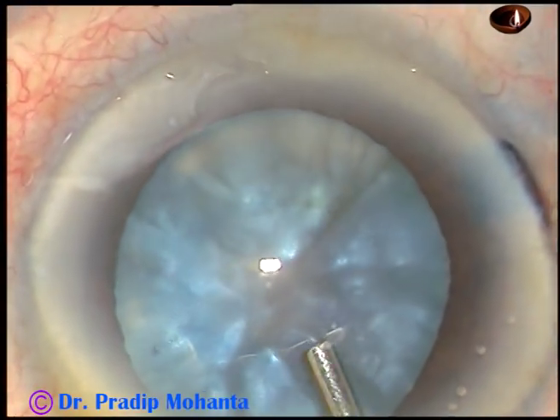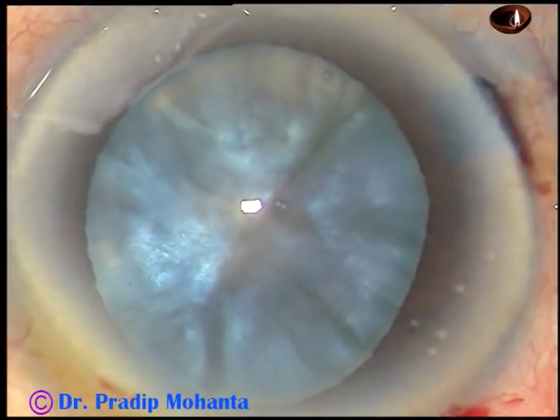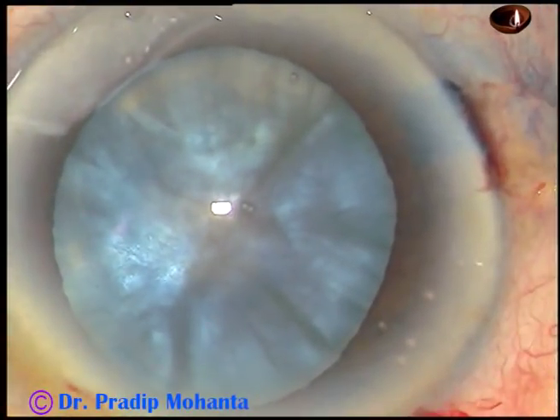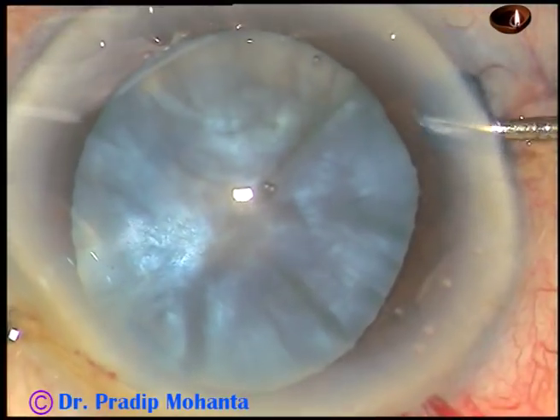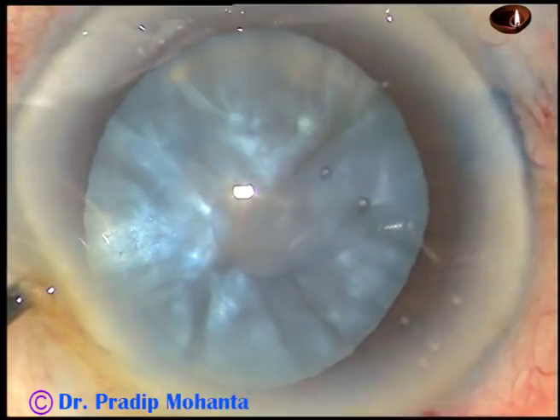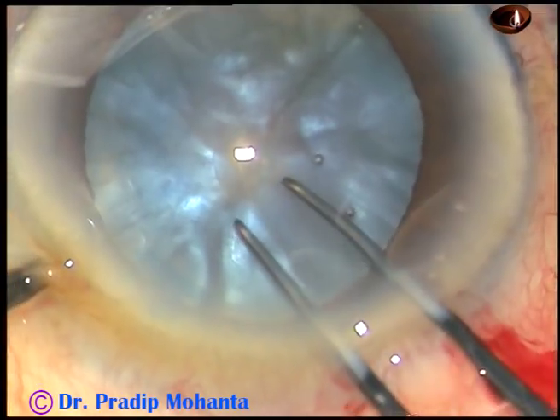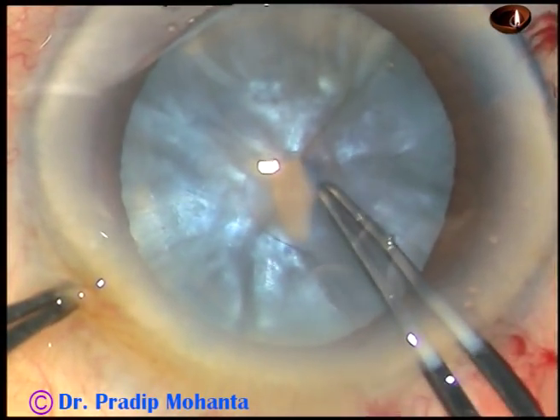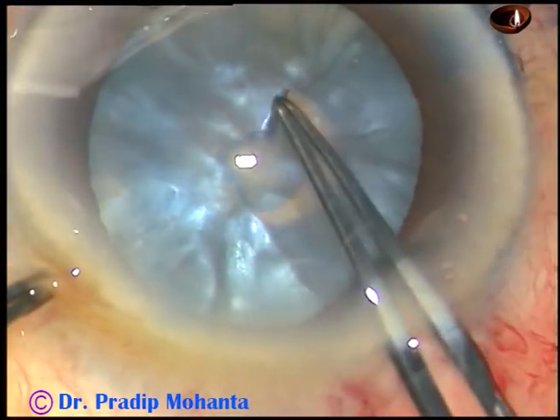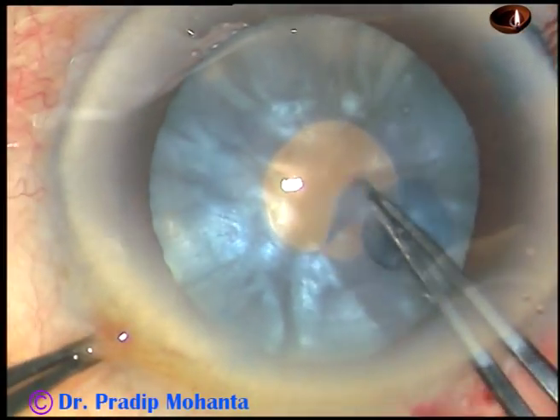Now the viscoelastic substance is injected again — this is HPMC. Now I am going to do the rhexis. Introduce this 26-gauge needle and incise the capsule right at the anterior pole. Now I hold this tag and do a very small rhexis at this time. Don't try to do an optimum-sized rhexis at this stage — I don't attempt it at all.